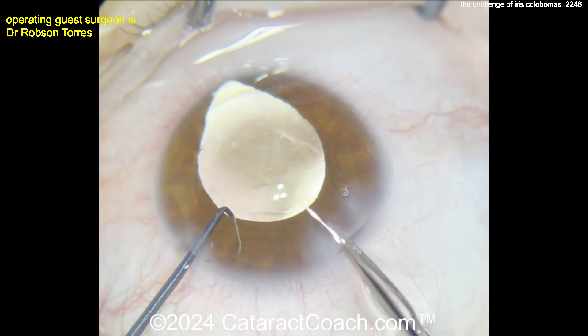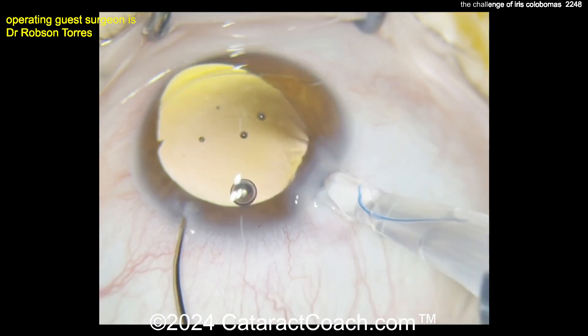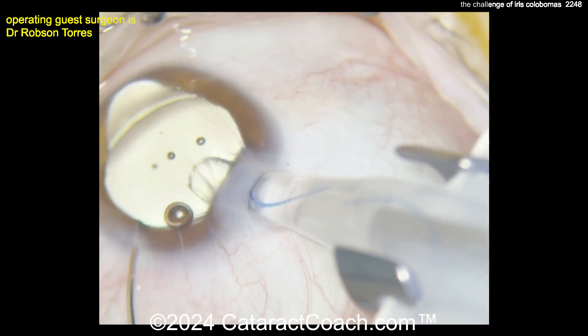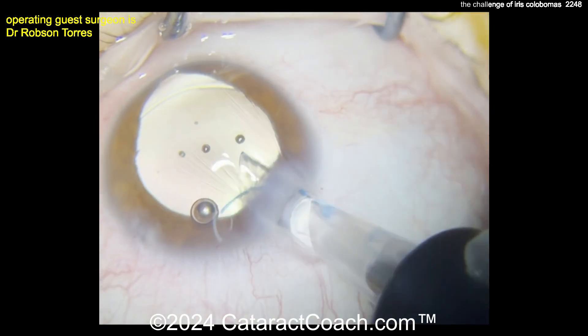The CTR is now in the capsule bag, and that looks pretty good. With the red reflex you can see the absence of zonules in that one quadrant of the iris coloboma. Now here comes a three-piece lens going into the eye, with good rotation of the tip.